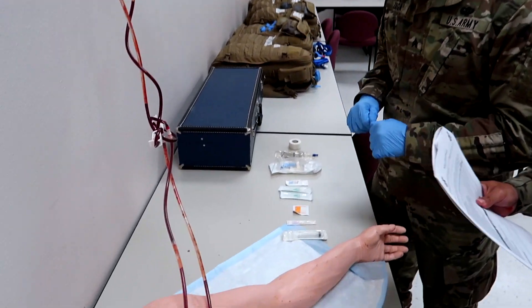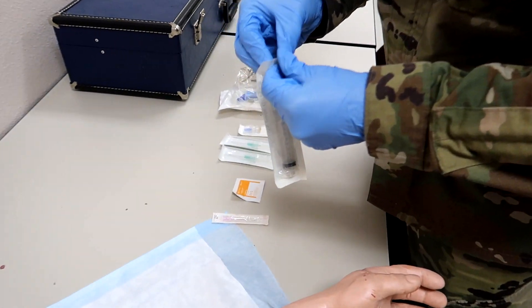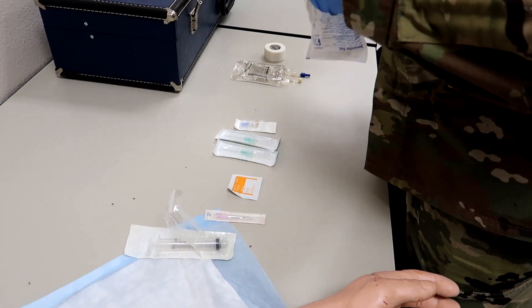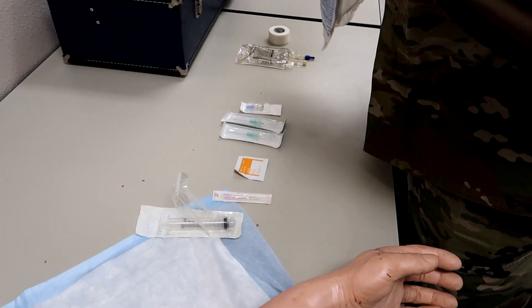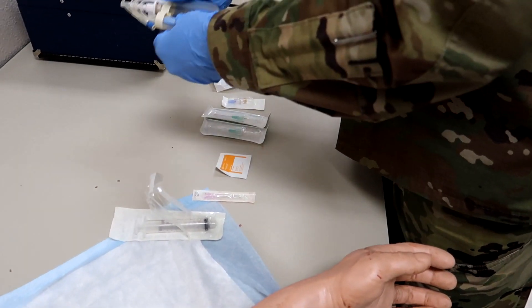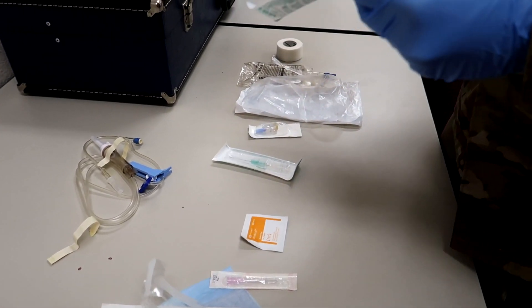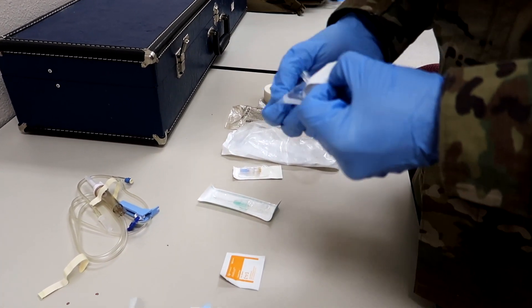I would try and have those gloves already ready because it does take away from time. So step two is gather, inspect, and prepare your equipment. This step is very important because you definitely want to make sure everything's opened, prepped, and ready to go for ease of access — because once you stick, you're only going to be working with pretty much one hand depending on how you occlude the catheter when attaching the saline lock or direct line. So right now you see him opening up everything, getting it set. He's got his line prepped, opening his needles, opening a syringe.